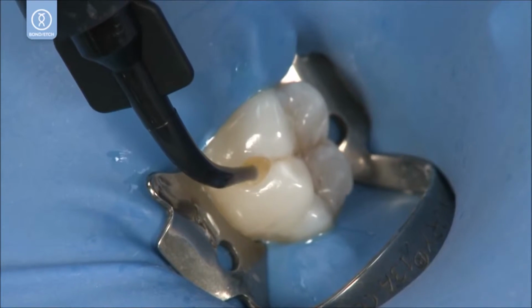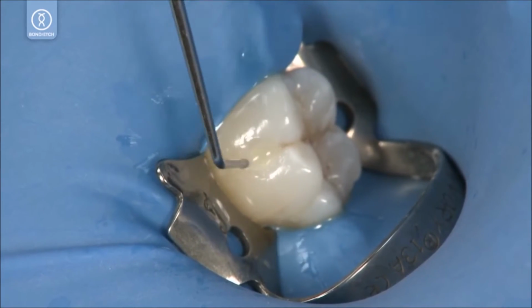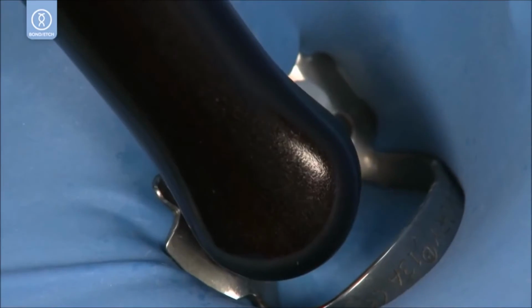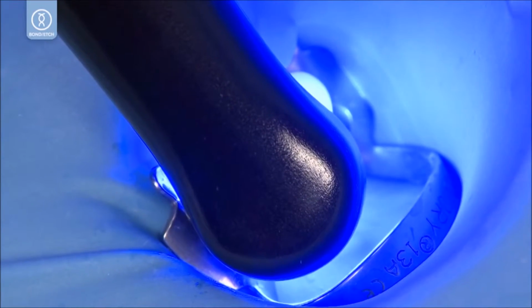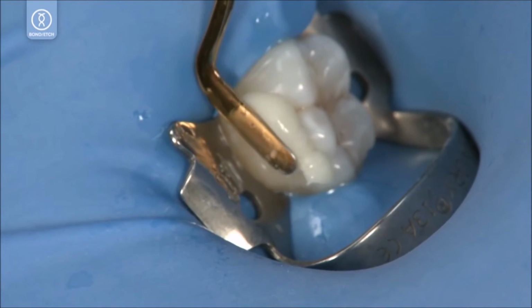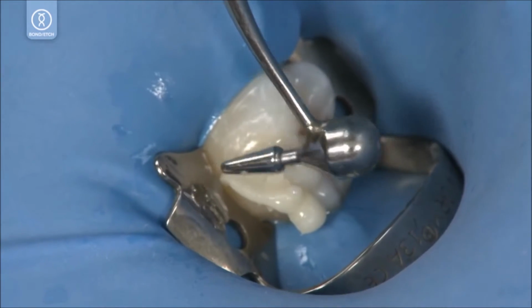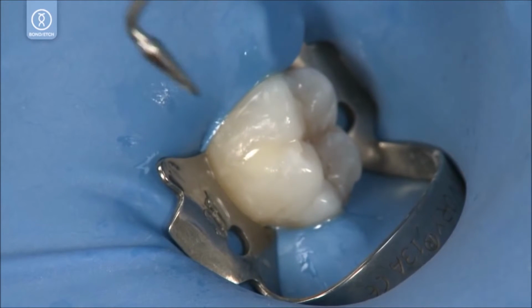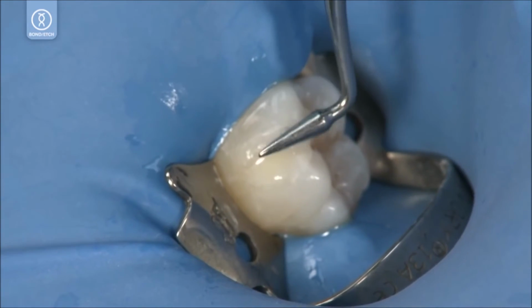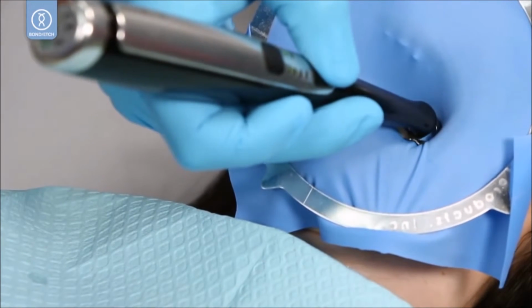Optional. Place PermaFlo flowable composite as a super adaptive layer. Light cure with Valo for 10 seconds. Apply Vit-l-escence or Amelogen Plus Composite. Light cure with Valo for 10 seconds.